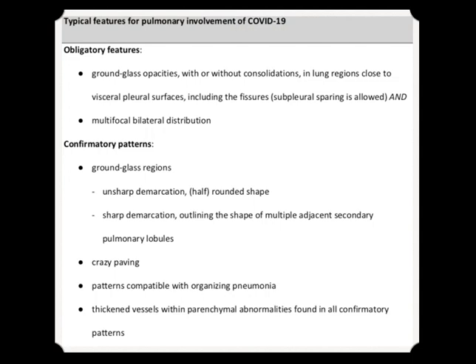Coming to the typical features before going into CORADS — these features are very important in categorization. The obligatory features are ground glass opacities with or without consolidations in lung regions close to the visceral pleural surfaces including the fissures, and multifocal bilateral distribution. Confirmatory patterns include unsharp demarcation of ground glass regions, half-round shaped sharp demarcation outlining multiple adjacent secondary pulmonary nodules, the crazy paving pattern, organizing pneumonia pattern, and thickened vessels within the parenchymal abnormality.